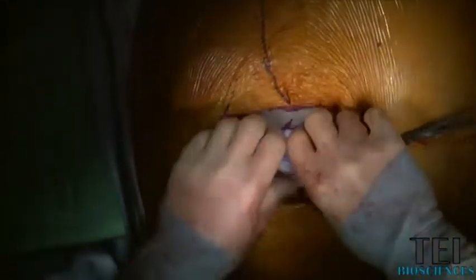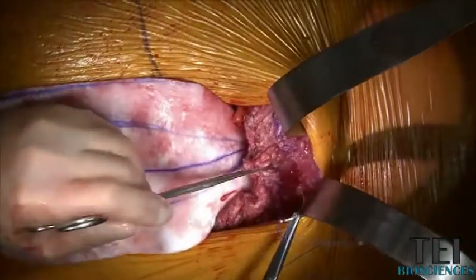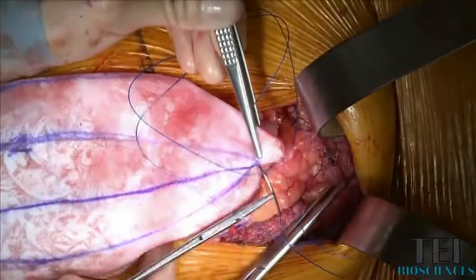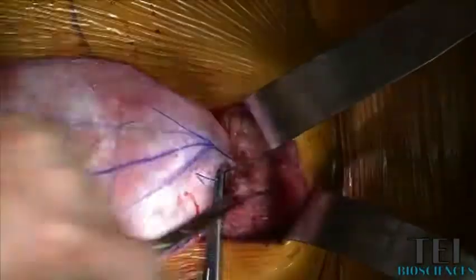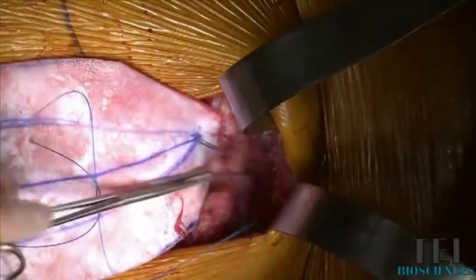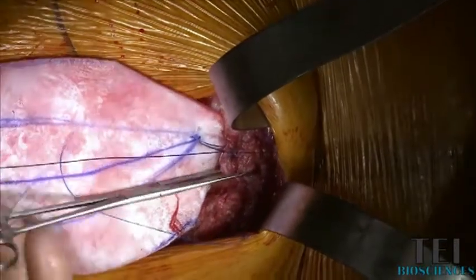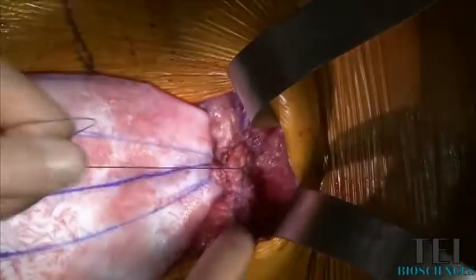We then place our mesh and just make sure that it's where we want. These are all number one horizontal mattress sutures — back out through the fascia. This one we tie up right away, and that brings the bioprosthetic up to the fascia at the apex of the wound.